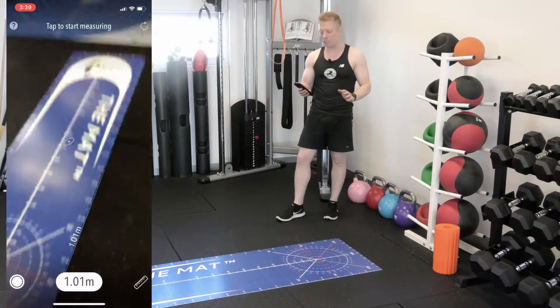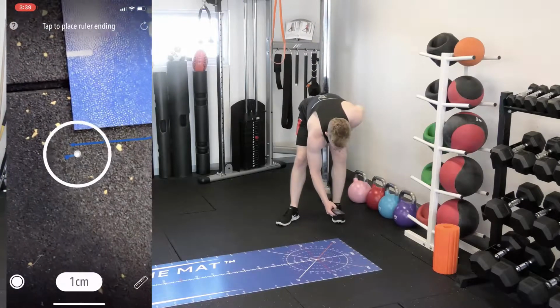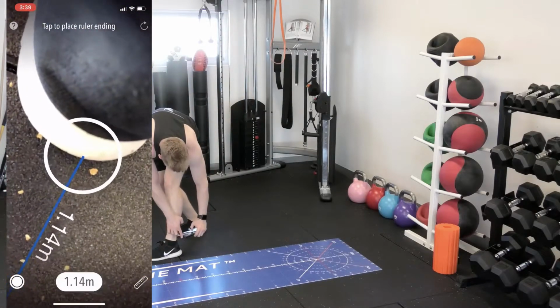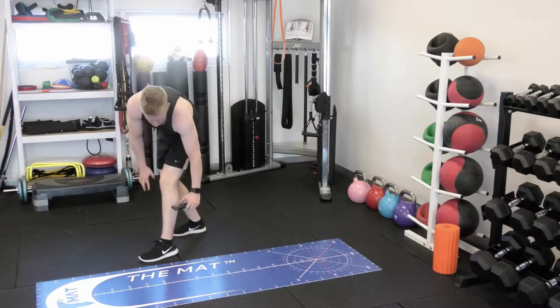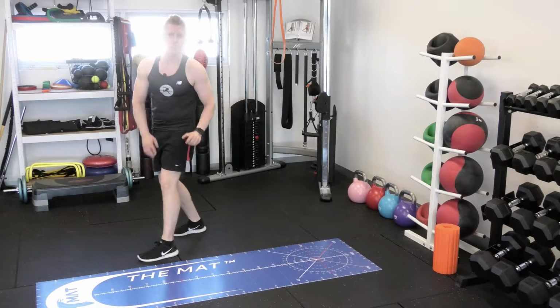So a really useful way you could use it for the hop test is to set that start point, and then we go and measure to that posterior aspect of the foot, and we measure there. And so it will pretty accurately tell me, so in this case, that we've hopped, you know, about 113 centimetres or so. In which we have a look at the mat, it's probably not too far off that. So if you haven't got a mat available, a really useful tool that you can use to start to get some objective data with your patients and clients.